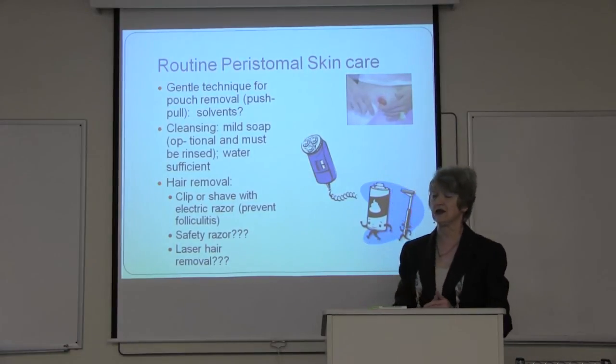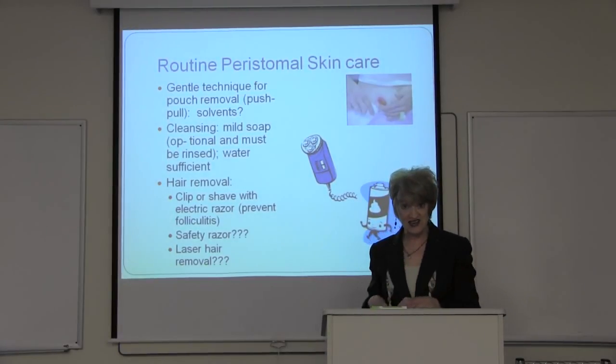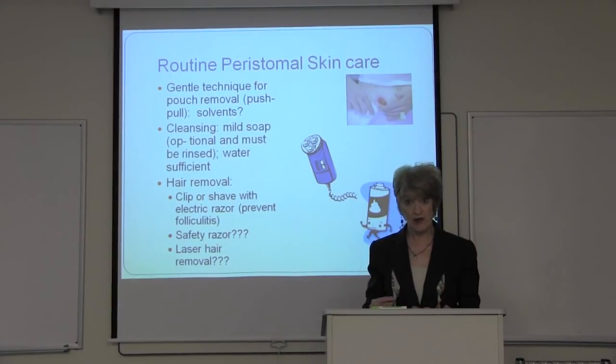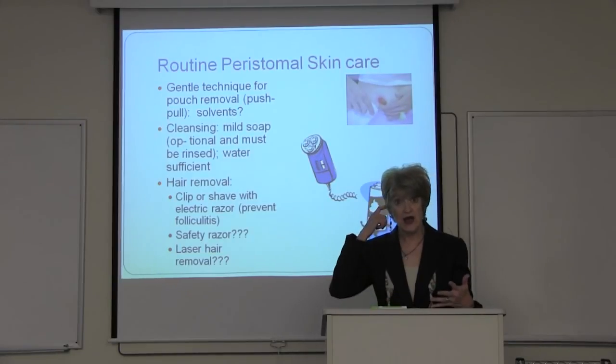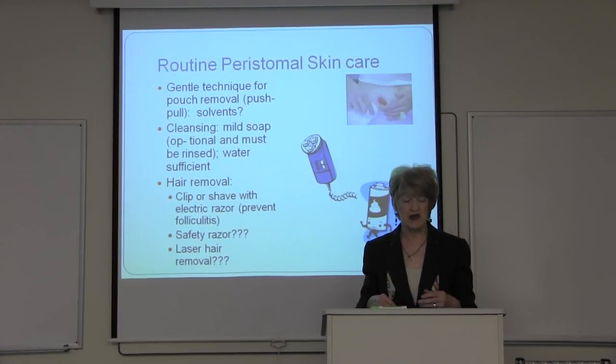In terms of cleansing, it depends on whether they're cleaning their stoma while sitting at the bedside or sitting in the bathroom, or if they're in the shower. So if they take off their pouch and get into the shower, which is one option that they have, then of course they're going to use their shower gel or a mild cleansing agent. And the main thing is to be sure that they rinse thoroughly to eliminate any soap residue and to eliminate any emollients, because you want to end up with a clean, dry surface to which the pouch will adhere effectively.